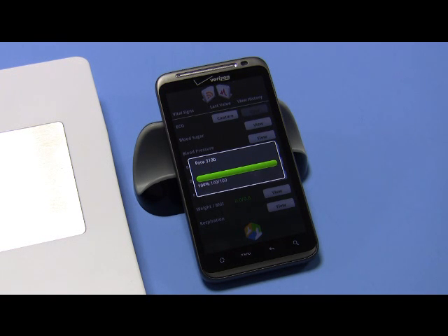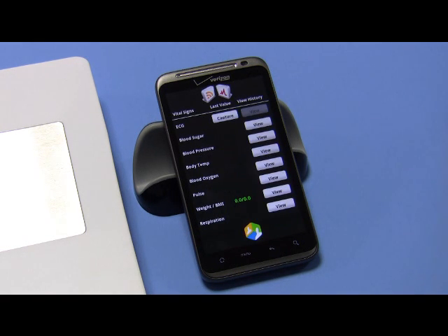Measurement acquired. Measurement stored. There you go! I'll send this over via email in a few minutes. That's it.